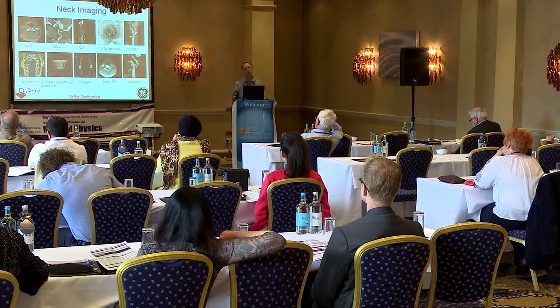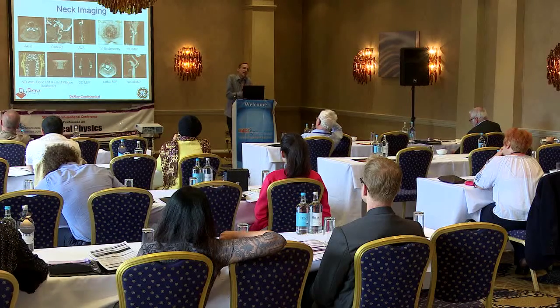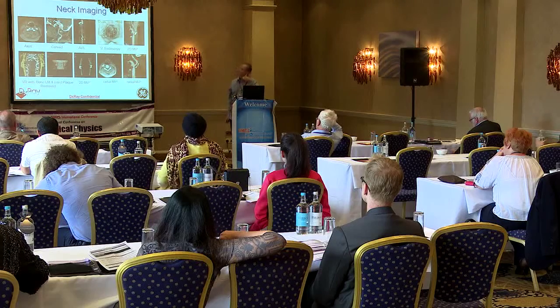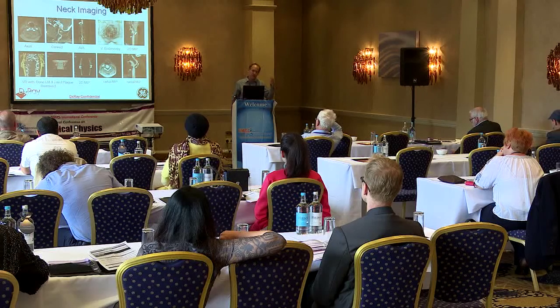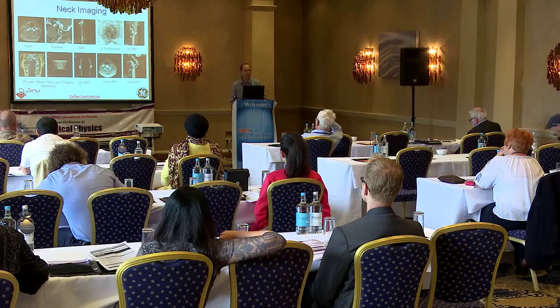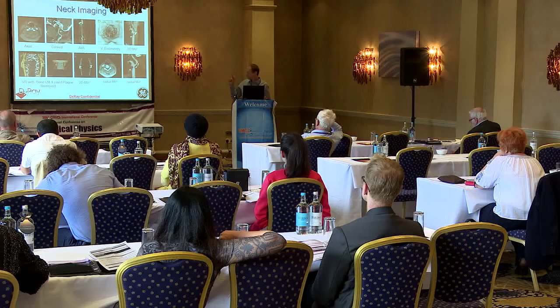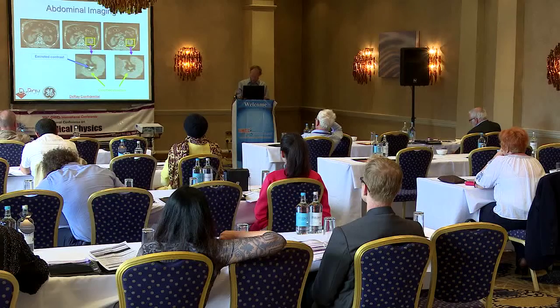And also, the data that you get from these types of detectors can be rendered in the same way that the data is rendered from conventional energy integrating CT systems. Shown here are some results, in particular the virtual endoscopy, which is a very good result that you cannot obtain with conventional systems.